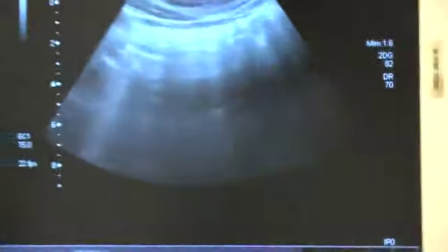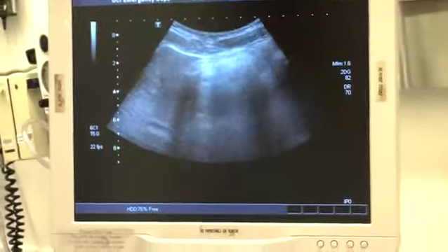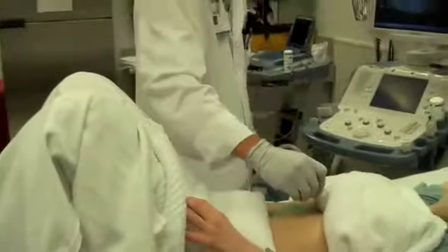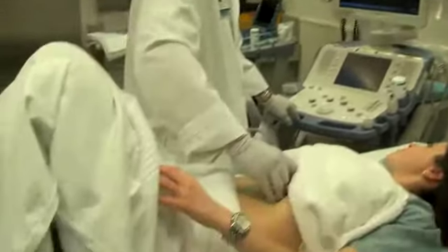Once your patient stops laughing and relaxes their abdomen, or should they have a taut or difficult abdomen, one trick to try is: bend your knees, please. Bend your legs. That'll relax their abdomen just a little bit. She's like, what are they doing to me now? So when you come back up here into the belly, just relax it. And again, our eye is going to gravitate toward the spine shadow. We see the aorta.